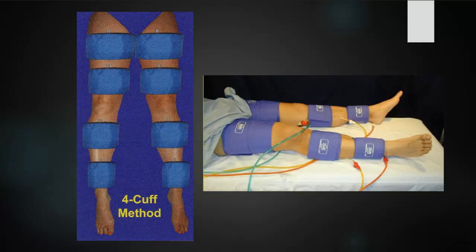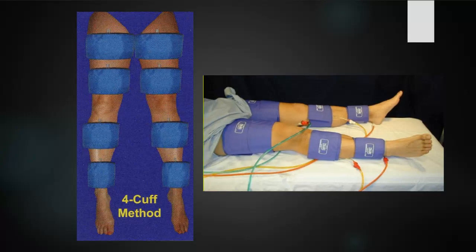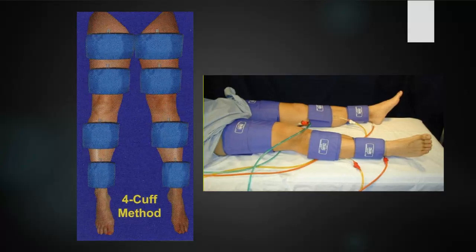Now we're going to be holding a continuous wave transducer, depending on our site's protocol, down either in the ankle or in the DPA of the toe. We need to make sure that we are on the right artery. So if we're using an ankle artery, we need to make sure that I'm in the PTA versus the peroneal artery, or I'm in the peroneal artery versus the PTA. So which way am I angling?